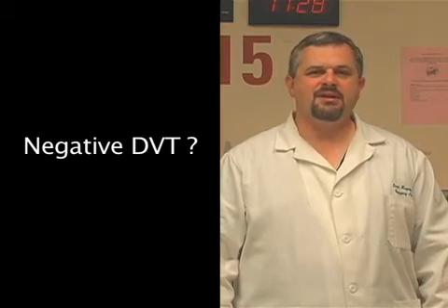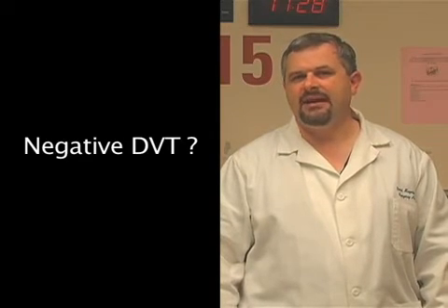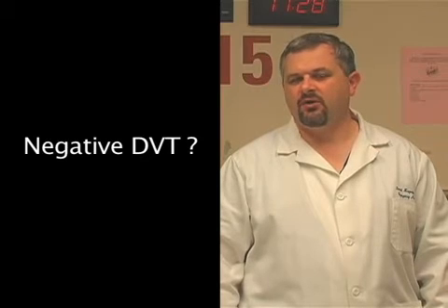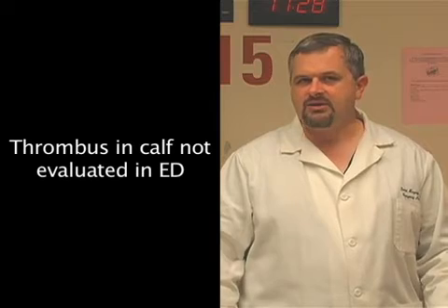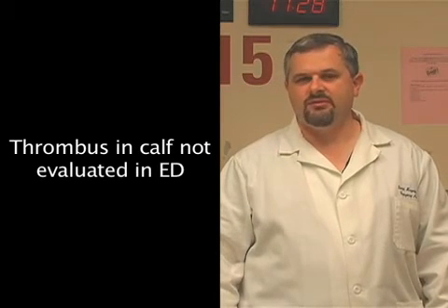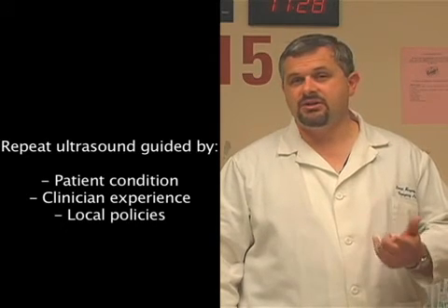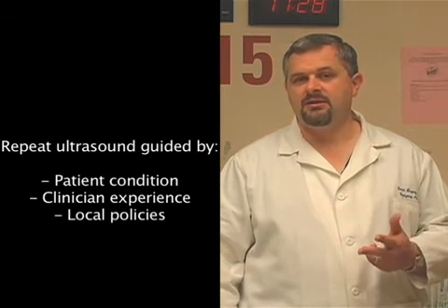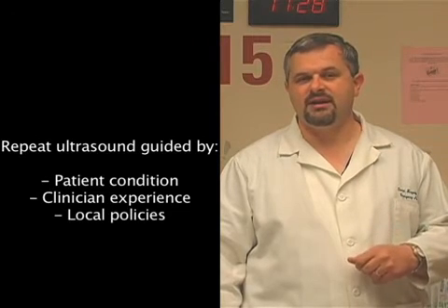Some controversy exists, without significant consensus, about the management of a negative emergency department ultrasound during the evaluation of DVTs. The possibility of a calf thrombus is not evaluated in the emergency department ultrasound. Therefore, patient condition, clinician experience, and local policies should guide the use of repeat ultrasounds 4 to 7 days later.